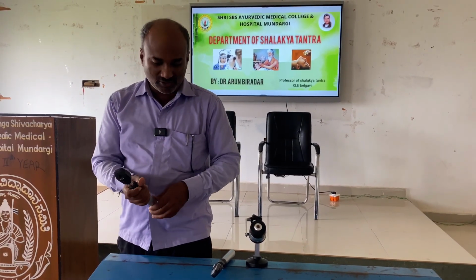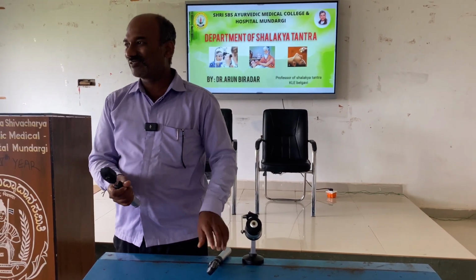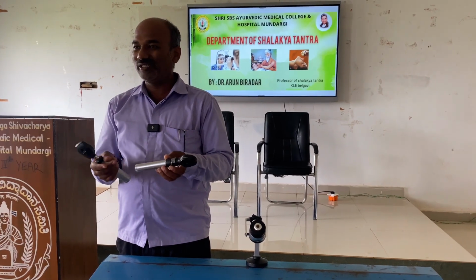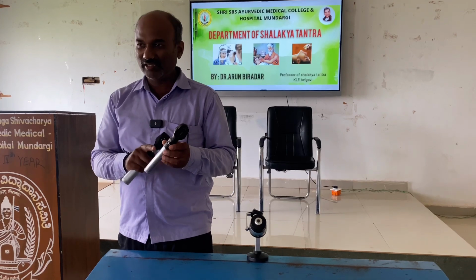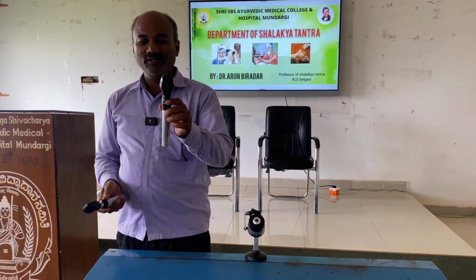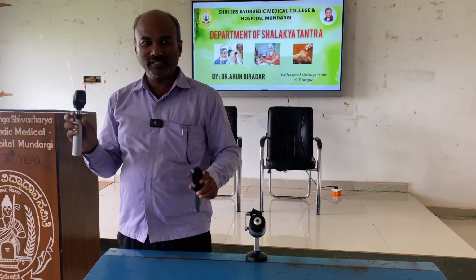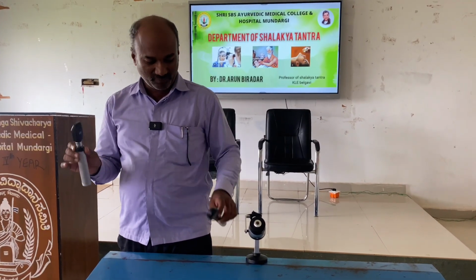And this instrument also comes with a rechargeable handle, but the battery cost is very high compared to the instrument cost. So we have changed it to removable batteries, and that too small pencil cells, right. The make of this instrument is Keeler, the make of this instrument is Zoomax, right. Both are instruments called ophthalmoscope only.